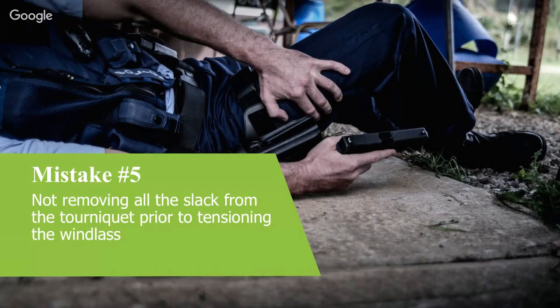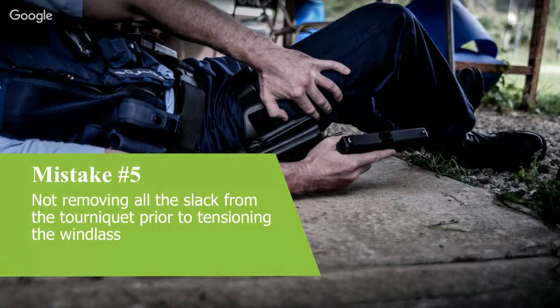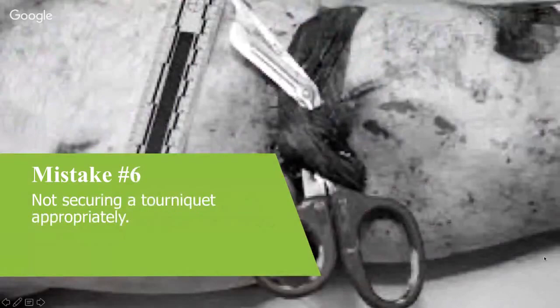Yeah, great. All right, I know I'm cognizant of time. Steve's already got to go due to work. So let's move on to mistake number 6: not securing a tourniquet appropriately, Dan.